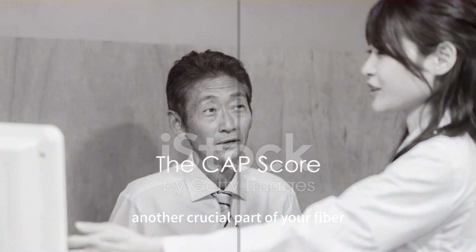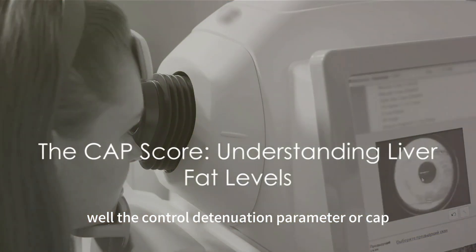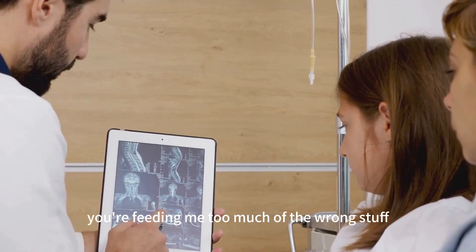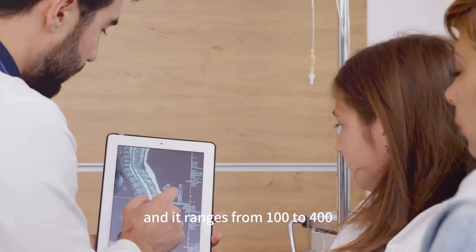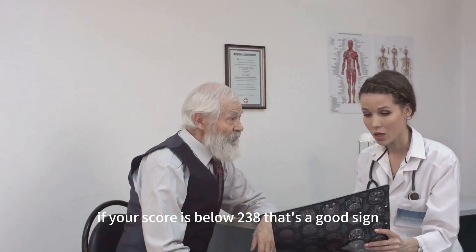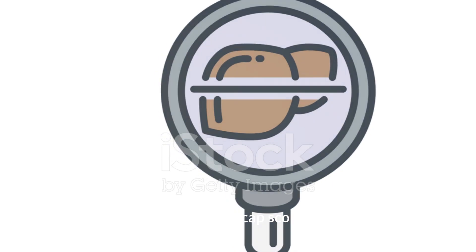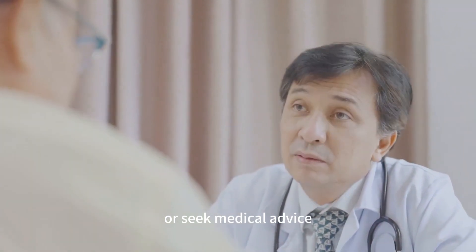Another crucial part of your FibroScan results is the CAP score. The controlled attenuation parameter, or CAP, is a measure of the amount of fat in your liver. CAP score is measured in decibels per meter, or dBm, and it ranges from 100 to 400. If your score is below 238, that's a good sign — your liver is managing to keep the fat levels under control. However, if your CAP score is above that, it might be time to rethink your diet and lifestyle or seek medical advice.